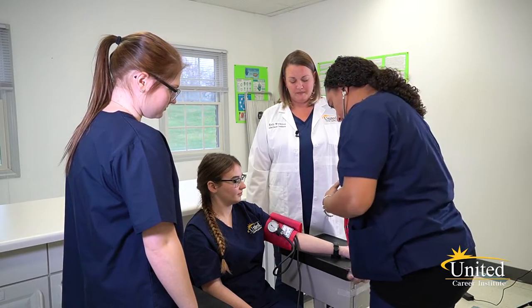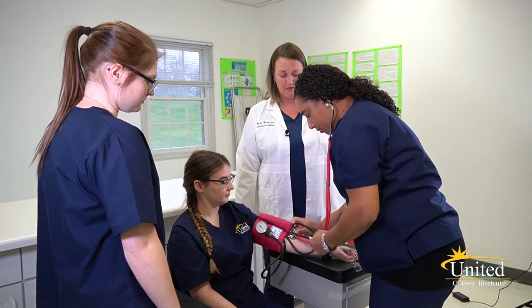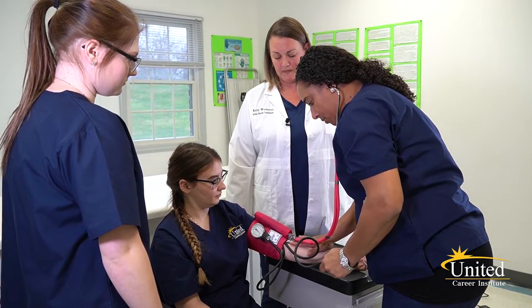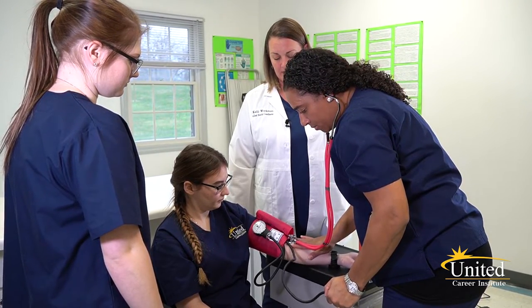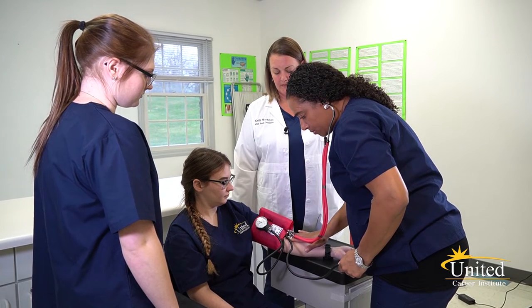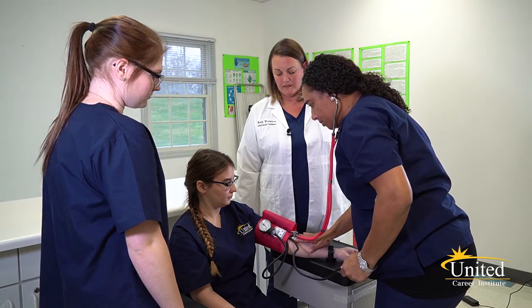You want to apply your chest piece to the artery, and then using the bulb on the blood pressure cuff, pump this patient to 140. The reading is 100 over 70.